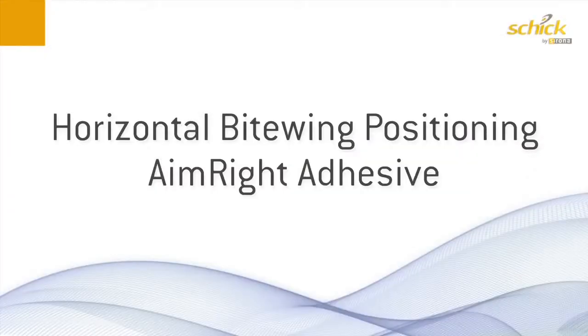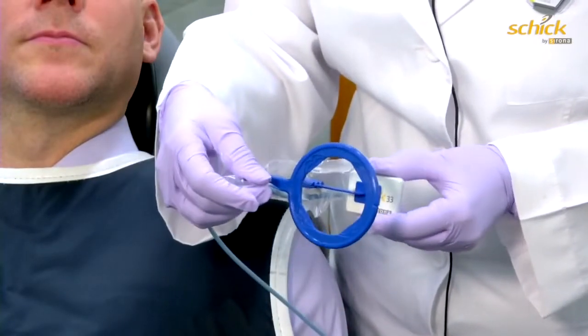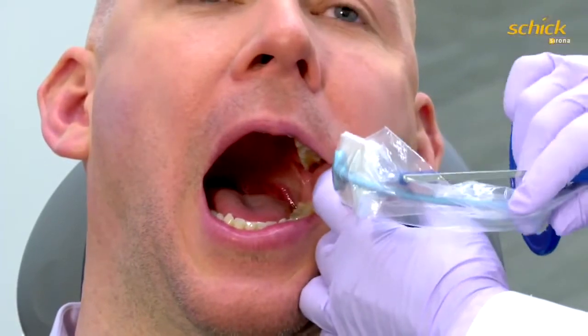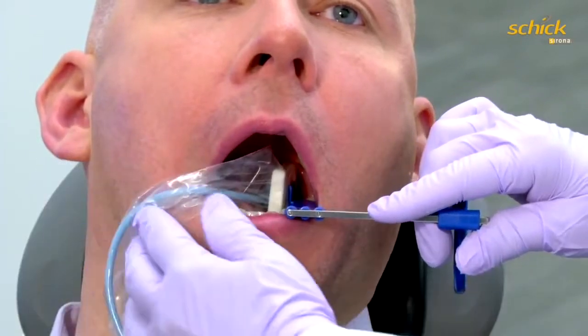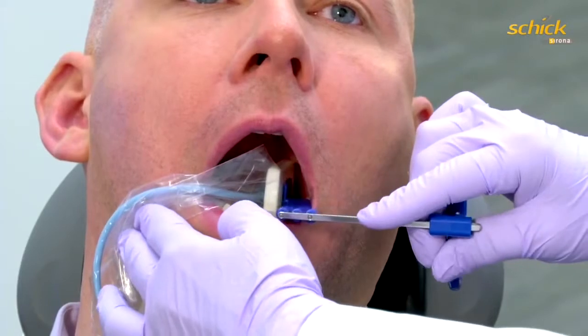For this shot, we're going to make sure that the tab is placed in the center of the sensor. Make sure that the cord follows the parallel arm. We're going to place this in the patient's mouth, give the patient a fishhook so that we can see what we're doing, place the sensor between the tongue and the teeth, and move the wire to the other side so that we can get a good visibility and see into the patient's mouth.